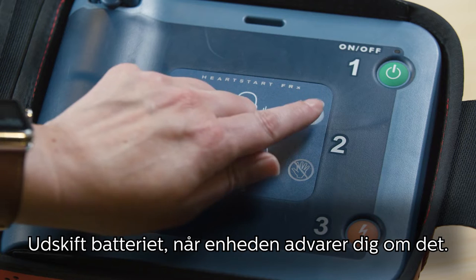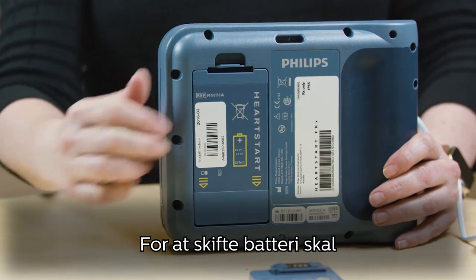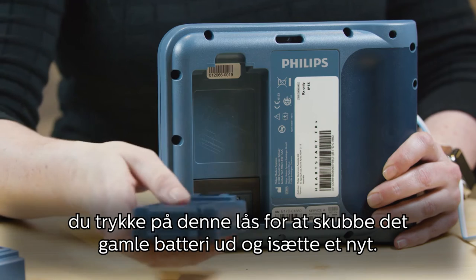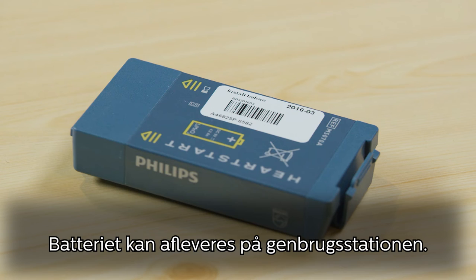Replace your battery when your device alerts you to. To change the battery, press the latch to pop out the old battery and slip in the new one, snapping the top firmly into place. The battery can be recycled at an appropriate recycling facility.